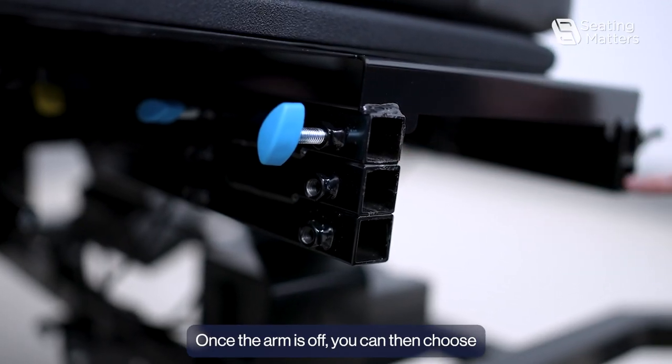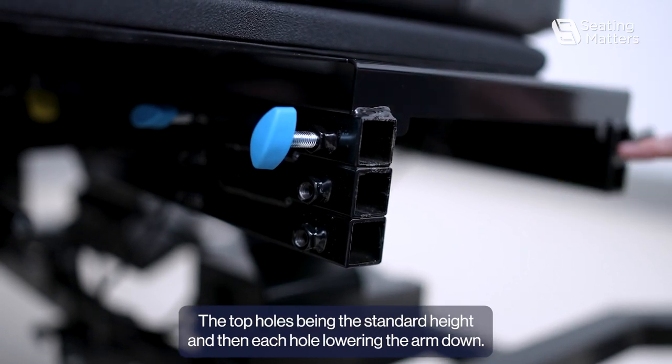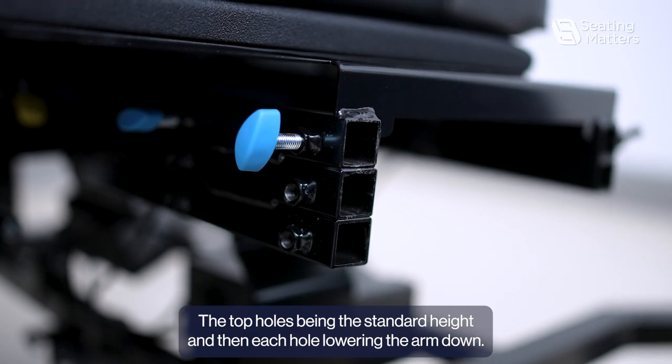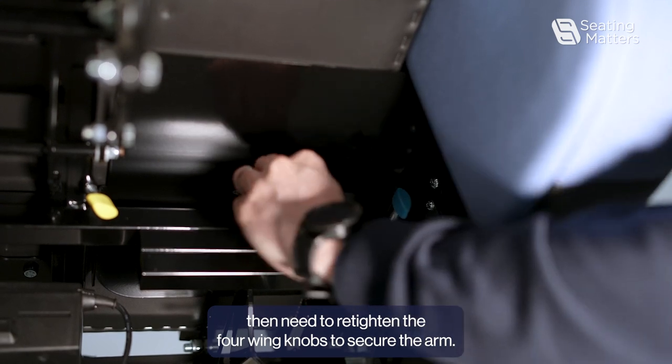Once the arm is off, you can then choose which height you want to put the arm back on. The top holes are the standard height, and each lower hole lowers the arm down. Once we have put the arm back in place, we will then need to re-tighten the four wing knobs to secure the arm.